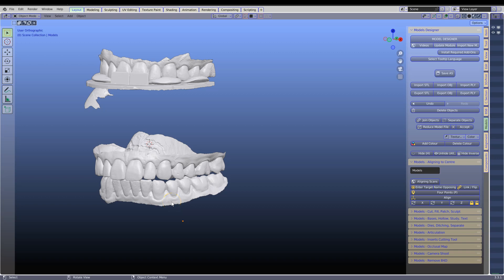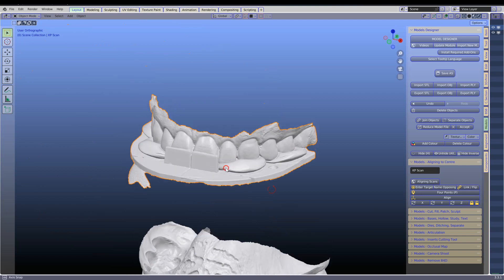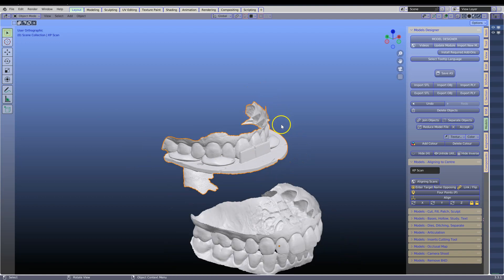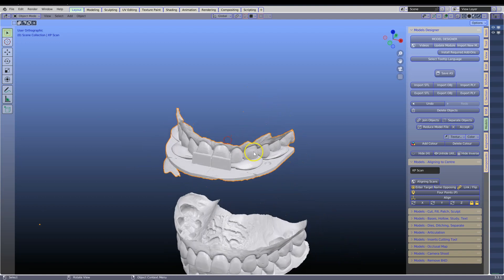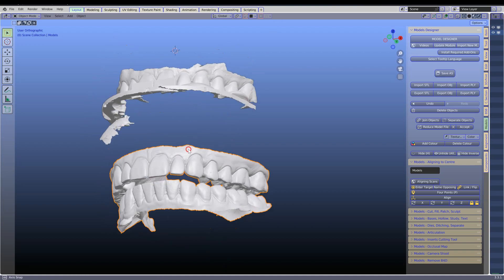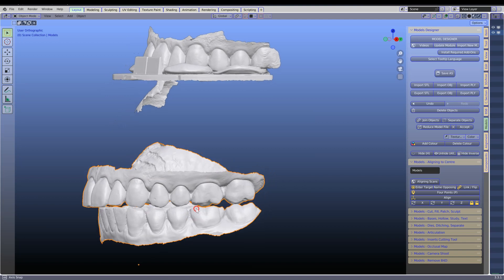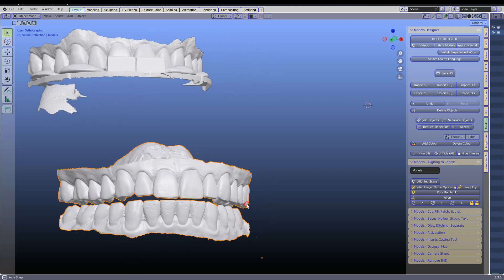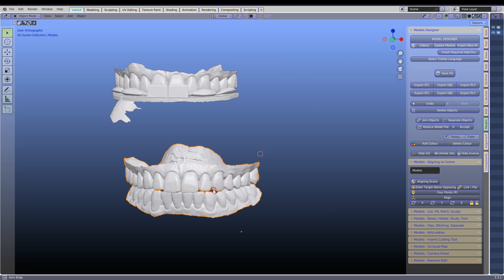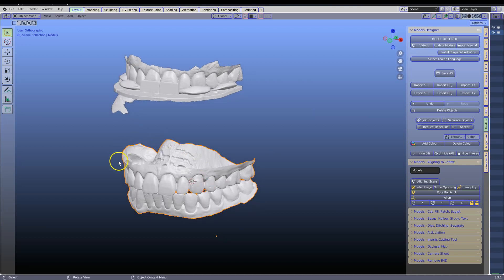In this video we're going to be learning about mounting on a Panadent articulator. First, we need an intraoral scan with the Kois plate in place. Import that into your Blender file. We also need an intraoral scan of the upper and lower in the occlusion that you have set in the patient's mouth. Make sure that these two are joined up into one STL model.